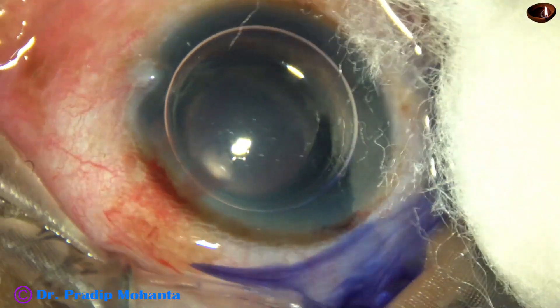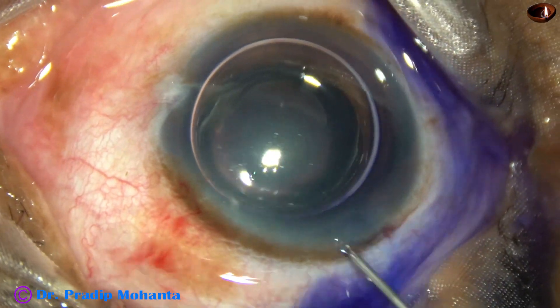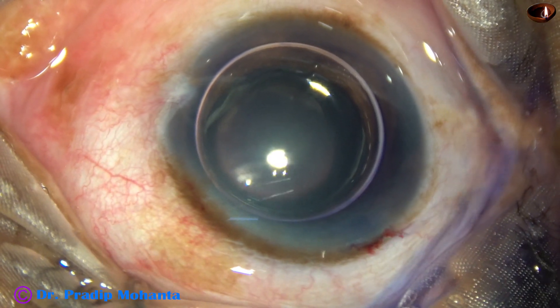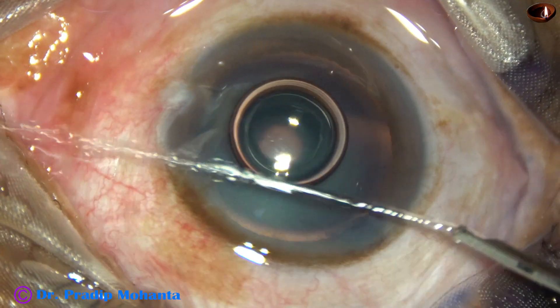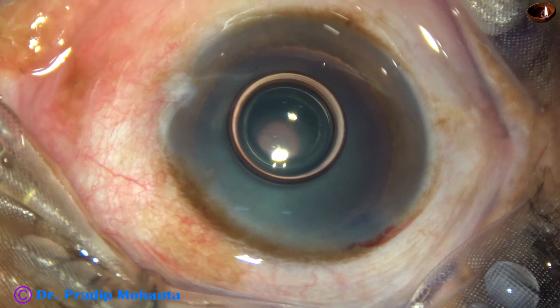I could do this without staining, but for better visibility I am using the trypan blue dye. The dye is washed out nicely using BSS or Ringer's lactate.